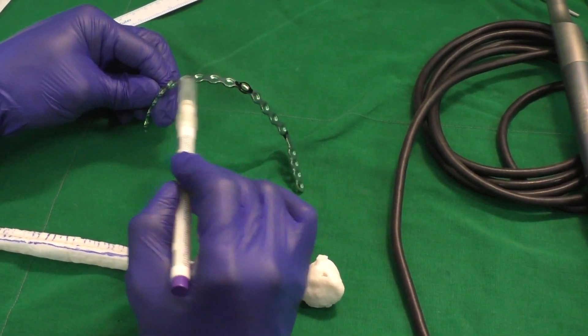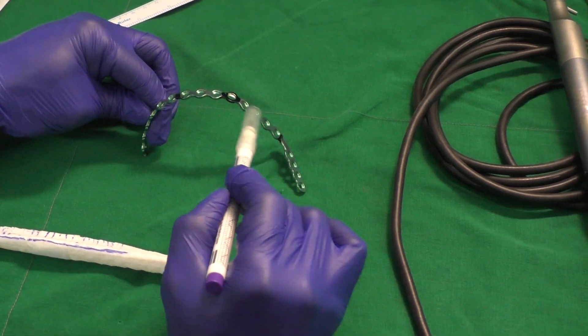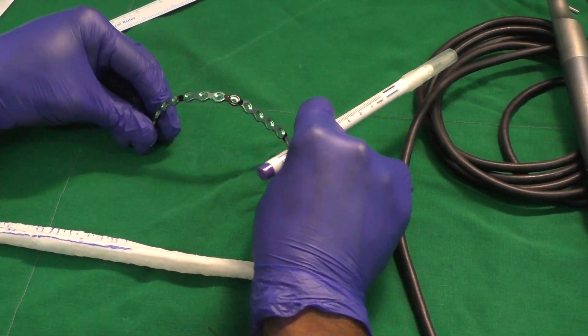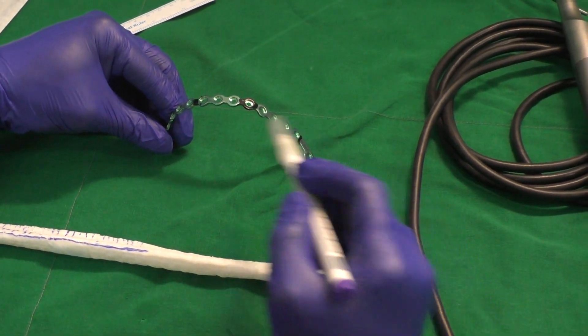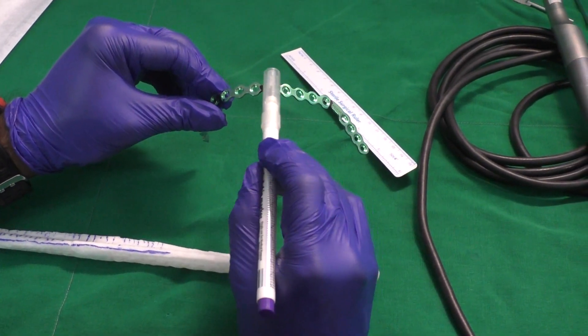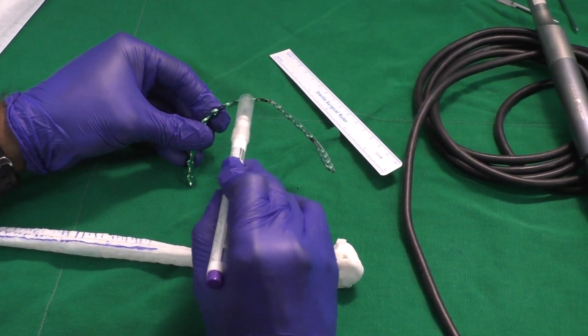So this is part of the first segment. The second segment here, the plating is done through the ramus, and here is where the osteotomy needs to be done.